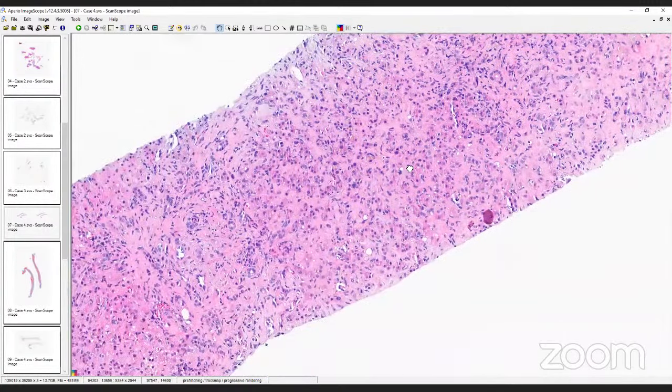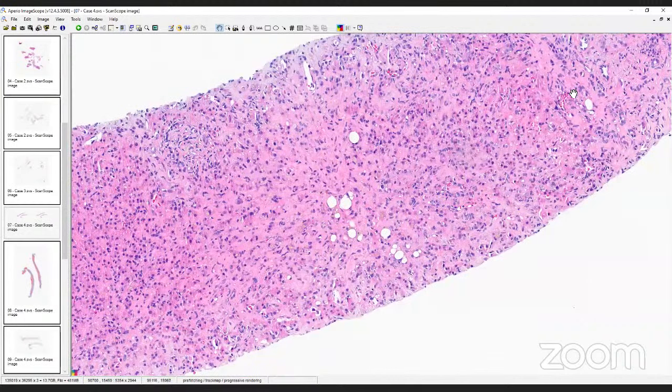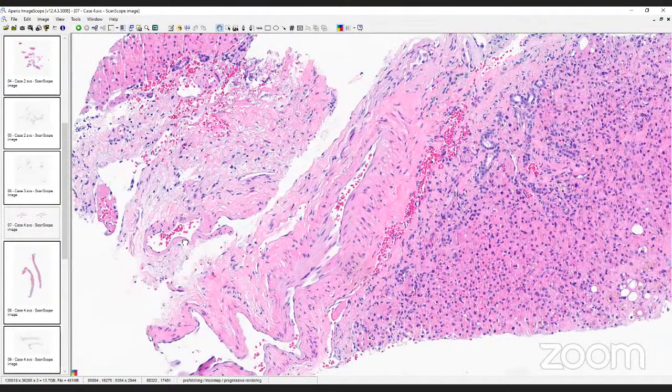I did not have a history initially. I just had liver lesions. And this is the biopsy that I had. I was seeing that there was some effacement of the architecture, but not a total replacement of the hepatic architecture. I was seeing that there were hepatocytes that were squashed. I was seeing a lot of fibrosis. And here, for example, there's a lot of fibrosis. So the first thought that came to my mind was epithelioid hemangioendothelioma.